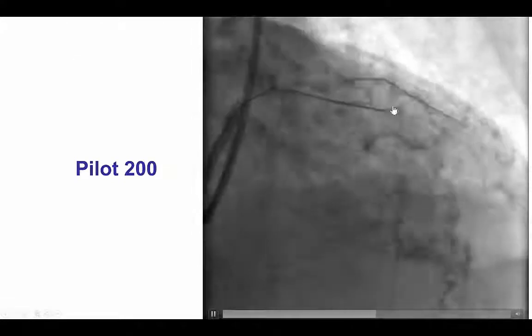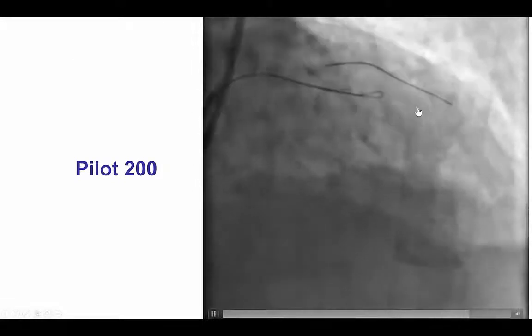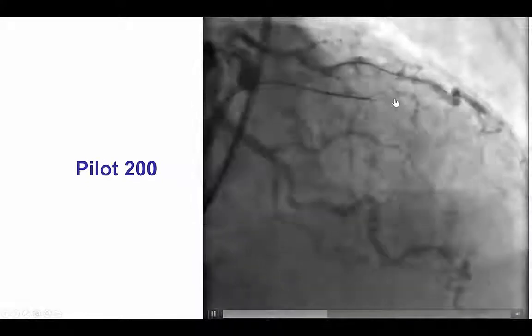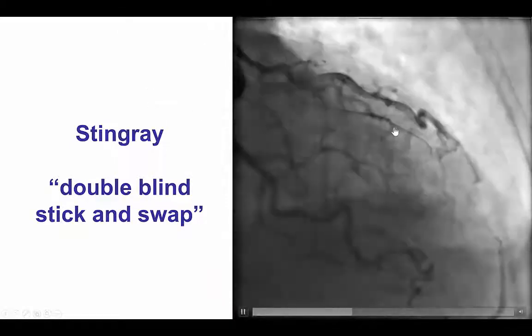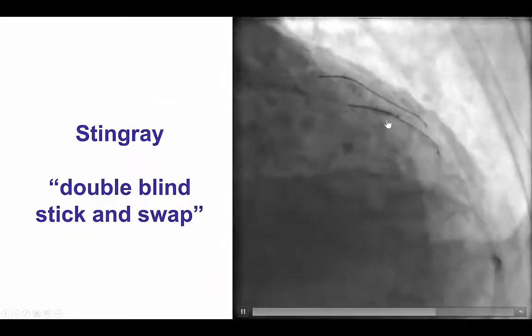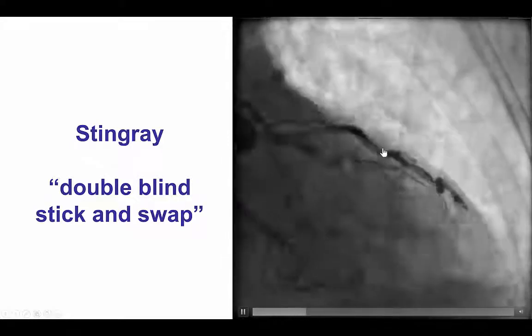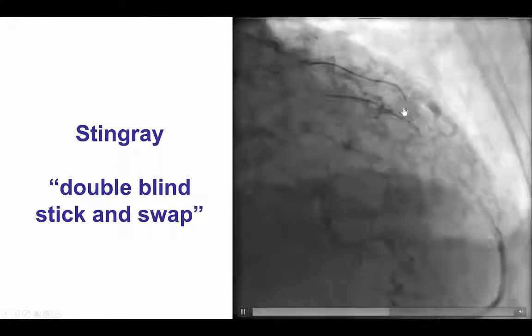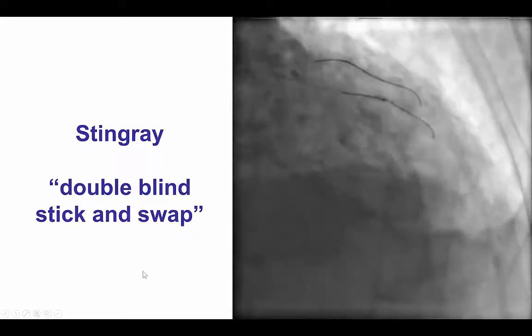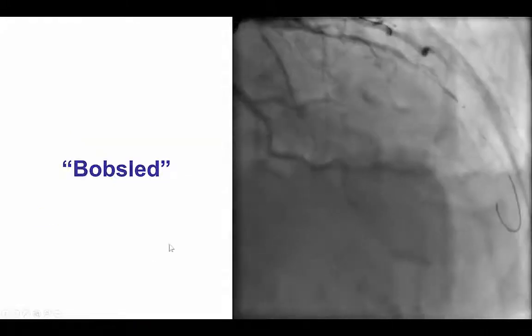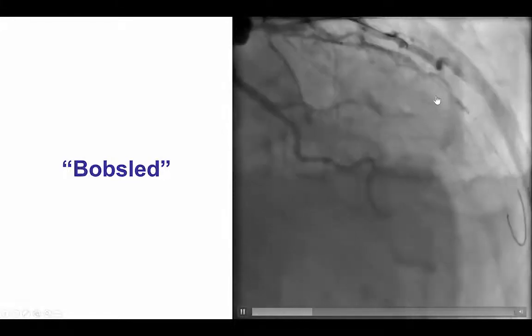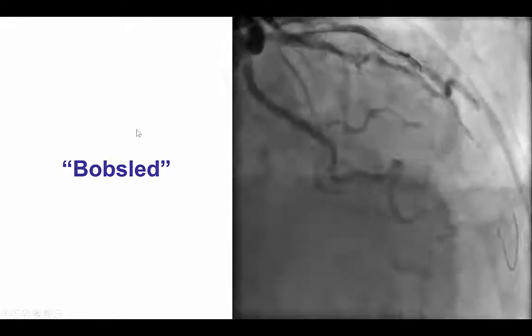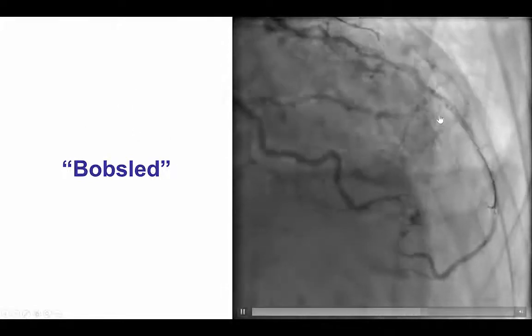We used the Pilot 200 as a knuckle to advance a little further down, again with nice movement of the guidewire in sync with the distal vessel. We then advanced a Stingray balloon and performed the double blind stick and swap, meaning we punctured on both sides of the balloon — up and down — then swapped for a Pilot 200 guidewire. That was unsuccessful in this location, so we moved the Stingray balloon further down, a maneuver commonly referred to as the bobsled maneuver, and attempted re-entry again.